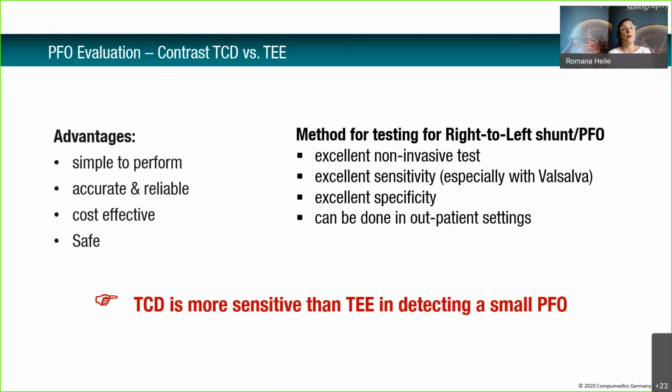Historically, TEE was supposed to be the gold standard, but it's not so accepted among patients because you have to swallow a probe, so it's uncomfortable, and it can also hurt the esophagus, so it's invasive, whereas TCD is non-invasive, it's safe, and in comparison is cheap, and it gives really accurate and reliable information, and therefore TCD has become a really good tool to diagnose PFO among patients.